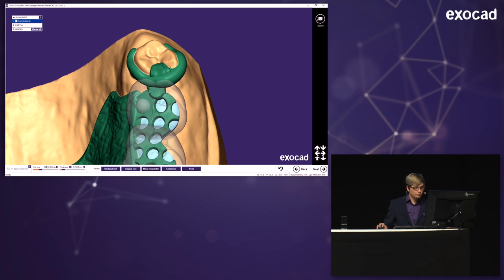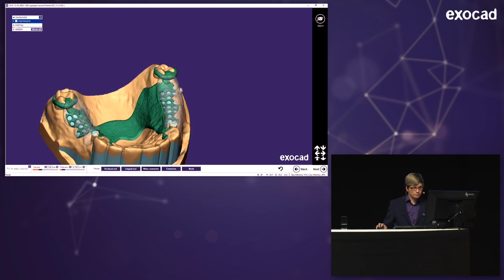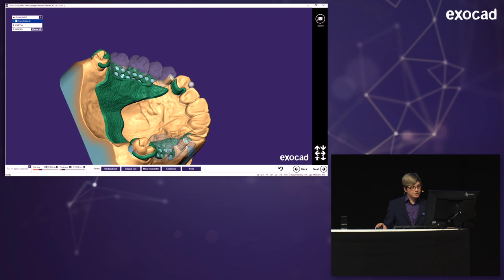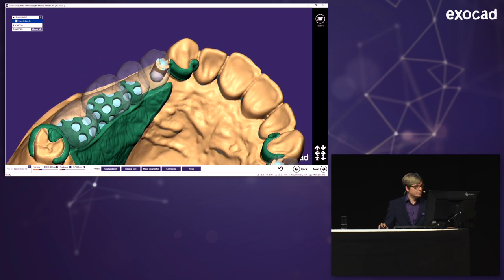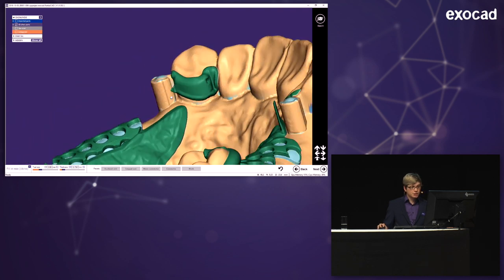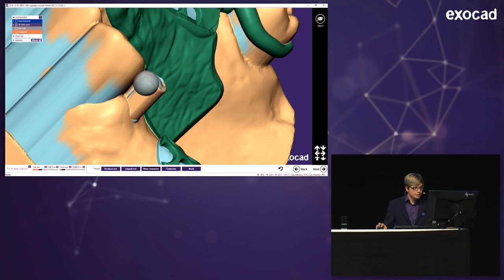Just fill in the mesh a little bit for more stability. So like this. Maybe a bit too much, but I think you get the idea. And now I'm filling up here. And for that, because I want to have a base around here, I'm hiding the important imported parts. I want to be sure that in the end, the partial completely fits around this attachment. So I think I'm taking the occlusal rest because it's really thin, and just add material all around here.